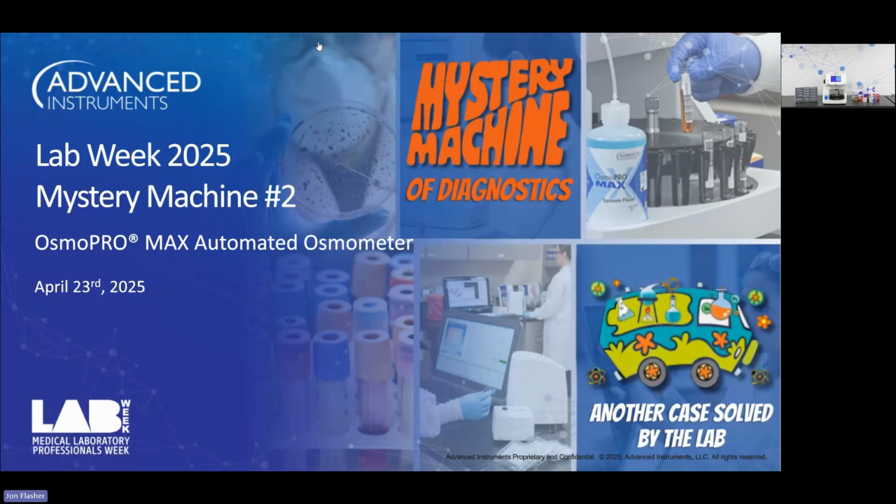Thank you everybody for taking time out of your busy workday to join our Lab Week Mystery Machine number 2 in a series of instruments that we'll be showcasing throughout the rest of the week.